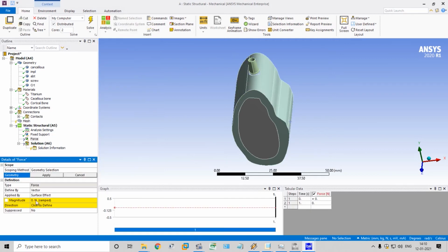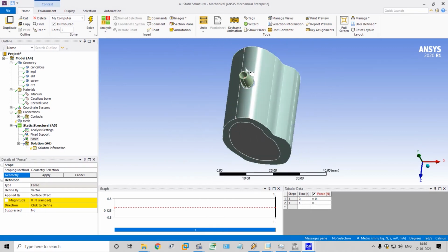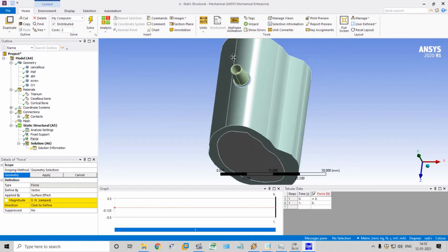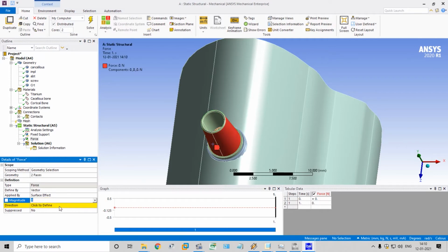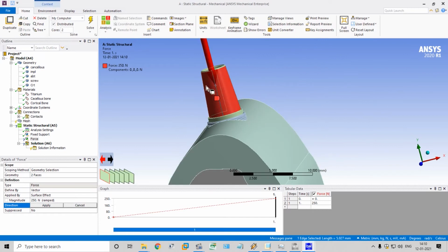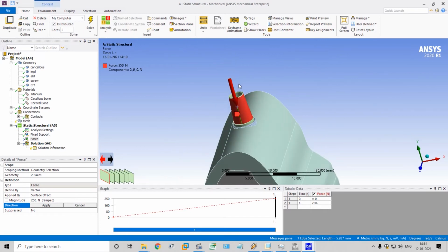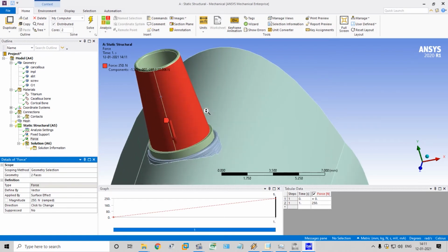Force application. Okay, which geometry are you going to apply the force to? This one and this one, apply it. Then how many Newtons of force? 250 we can give. Direction: this direction, this direction inside. Y-axis negative. You can see the arrow mark now.